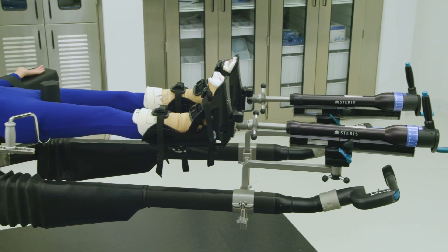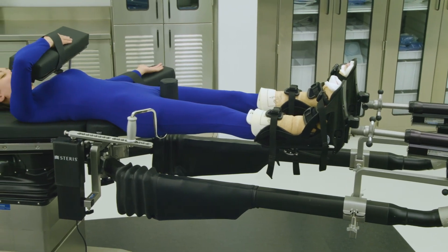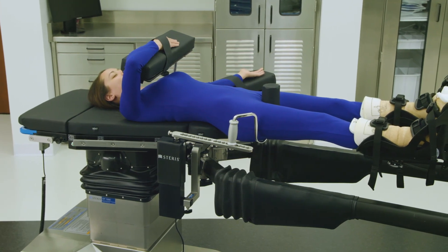When setup is complete, the Steris OT Table should look like this for the intended procedure. Refer to the OT Table Setup Guide, pages 8 through 21, for written instructions on setting up the table for this orthopedic case.